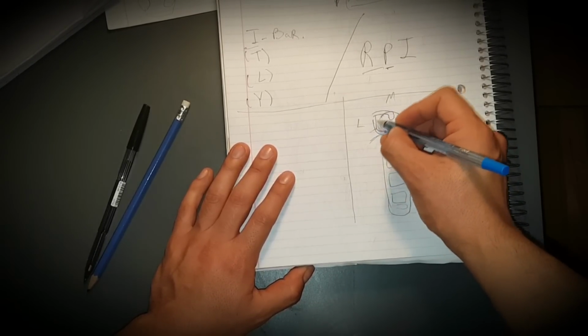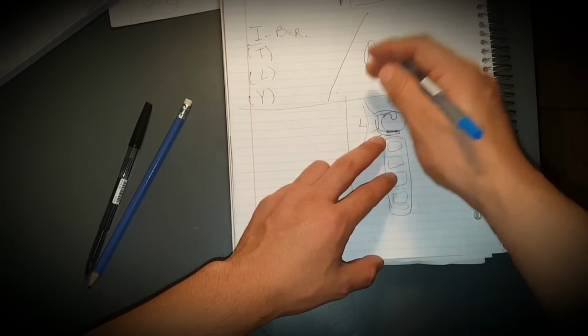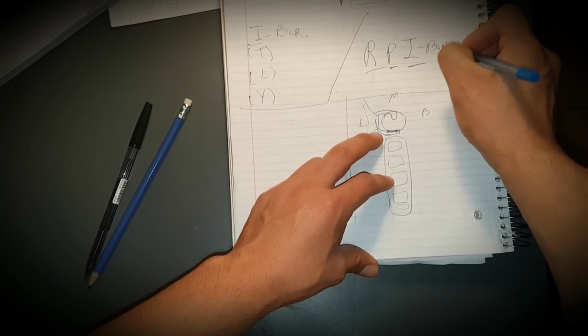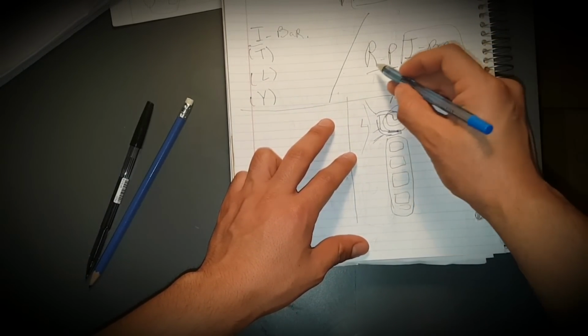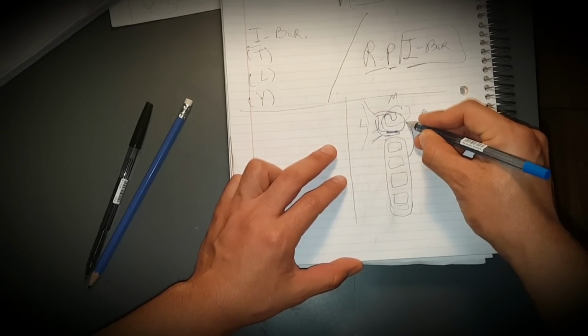Here it continues with the structure of the major connector, and the I is the I bar. So one thing is the RPI, which has a mesial rest, and the bar comes from here.